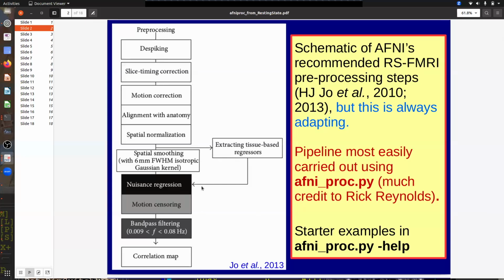We're going to be performing a general linear model to clean up the data, remove features like subject motion or baseline changes that can happen in different things, and try to get at a measurement of what we want. So all of these features here happen in a regression step.